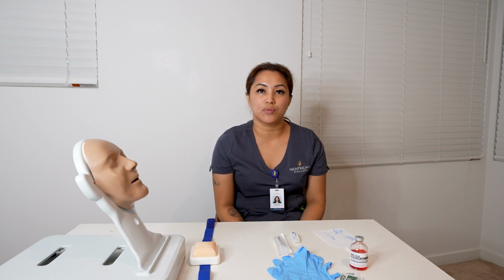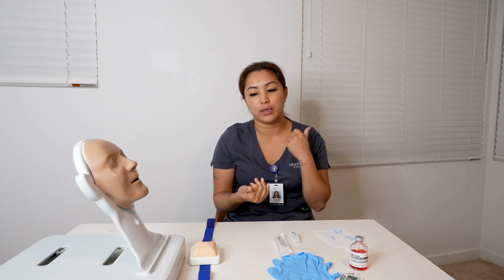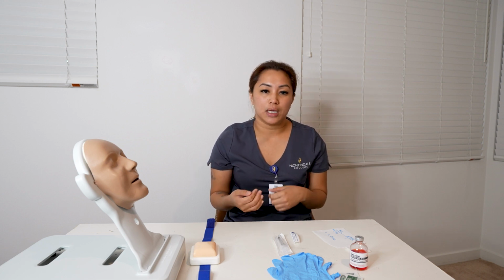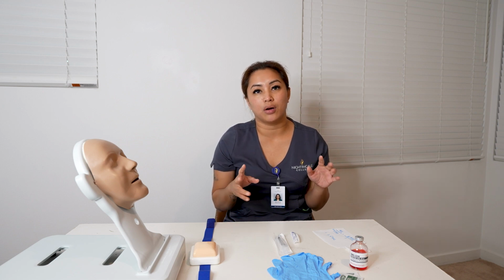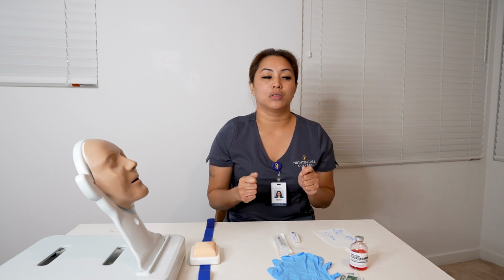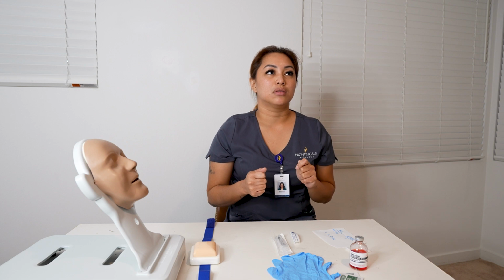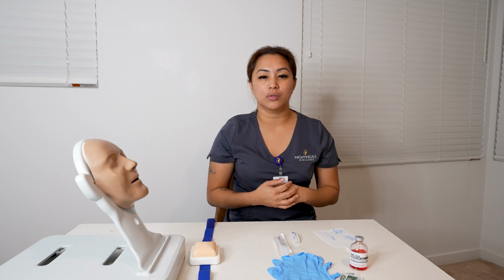Before I start, I am going to verify the 6 rights: right patient, right drug, right dose, right time, right route, right documentation. Alrighty. So now I'm going to check the EHR, MAR to see what the provider ordered. So he ordered 6 milligrams morphine sulfate IM by 1 dose.